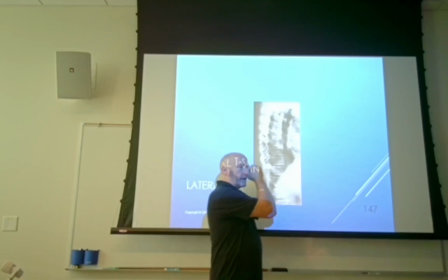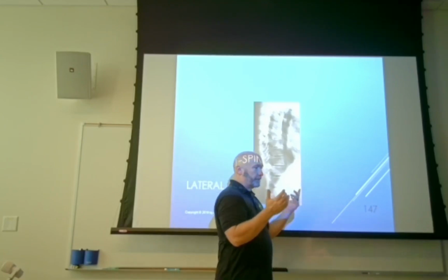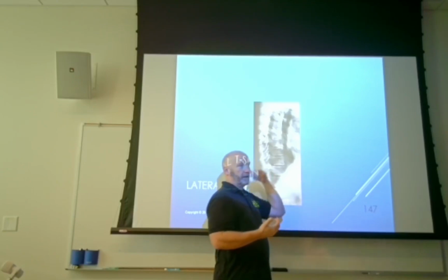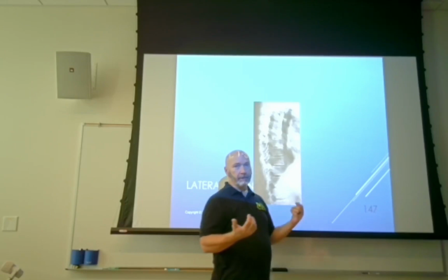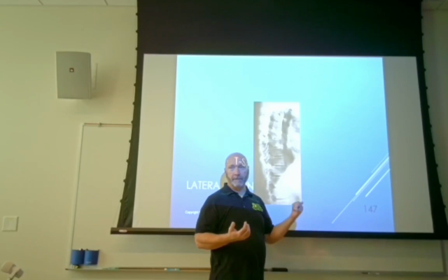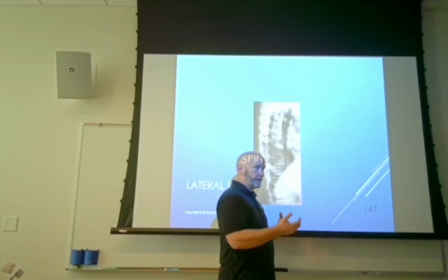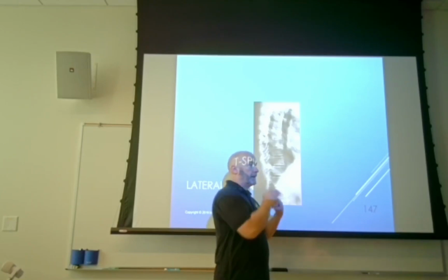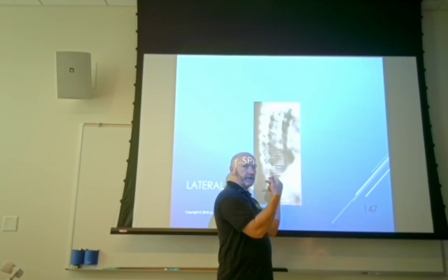So get the patient into a lateral position, and again, full disclosure, I've never shot intentionally oblique T-spines in my entire career. You just don't see them a whole lot. You don't see a whole lot of T-spines, but certainly you don't see a whole lot of oblique T-spines. It's generally just going to be AP and lateral. Anything beyond that, patient's going to go to CT. So it doesn't matter if you're doing AP or PA, but it's going to be a 70-degree oblique.